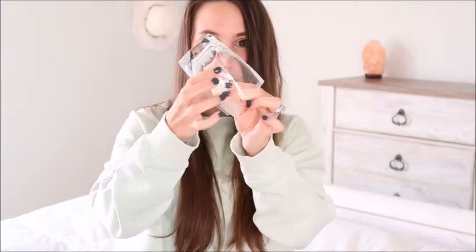For a normal person, they would just fold the cup and then stick the folded rim in first. So it would go in, let me get my cup, it would go in first, but for me, I have to flip it. Instead of putting the folded in down at the bottom, I flip it this way, so the folded in is at the top, and then I insert it so that the folded in is opening first. For me, that helps me to have less leaks.